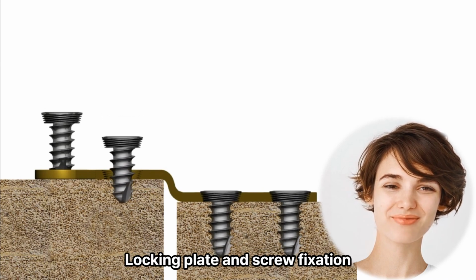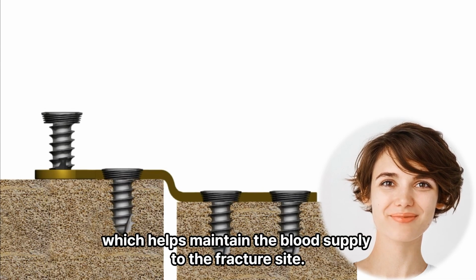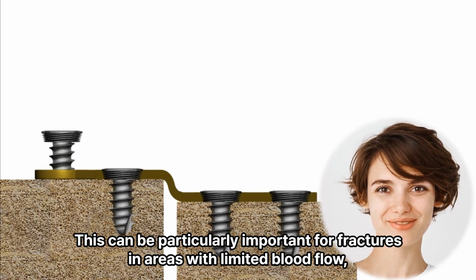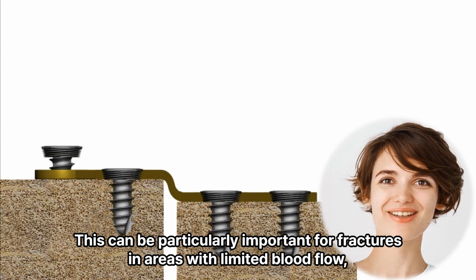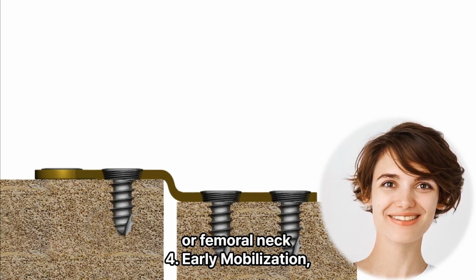3. Preservation of blood supply. Locking plate and screw fixation does not rely on compression between the bone fragments, which helps maintain the blood supply to the fracture site. This can be particularly important for fractures in areas with limited blood flow, such as the distal tibia or femoral neck.